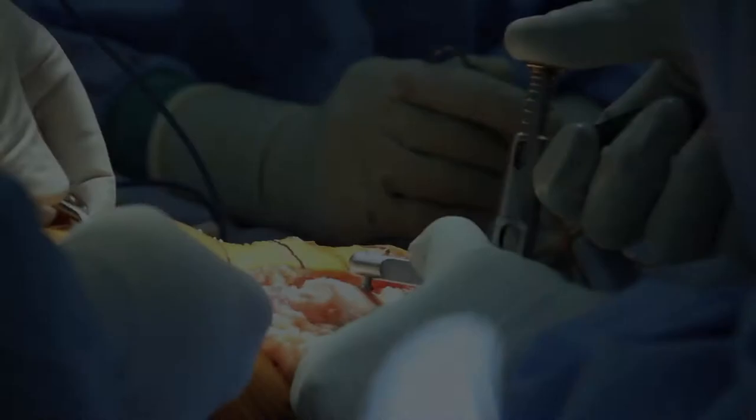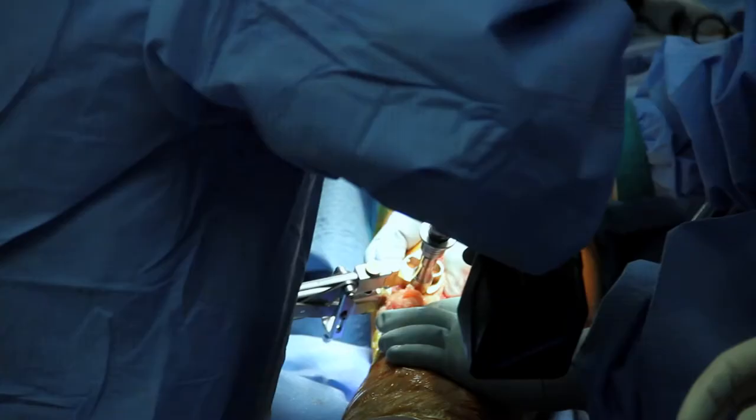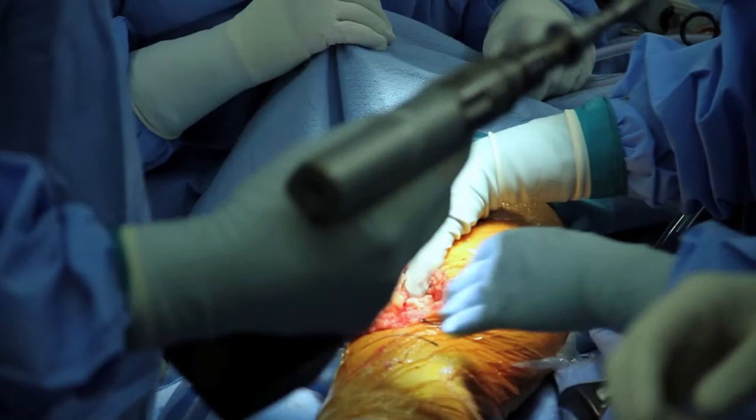In the United States, the patella is most often resurfaced with knee replacement surgery. The patient's age can also play a role in whether or not the patella is resurfaced in this operation. A retro patellar cut is made removing the cartilage on the backside of the patella, and a button is fit to the back of the patella in a similar way to the tibia and femur articulations.